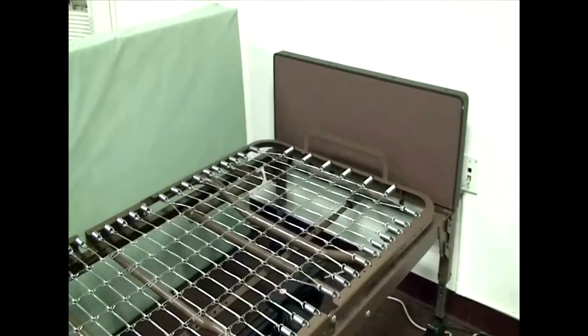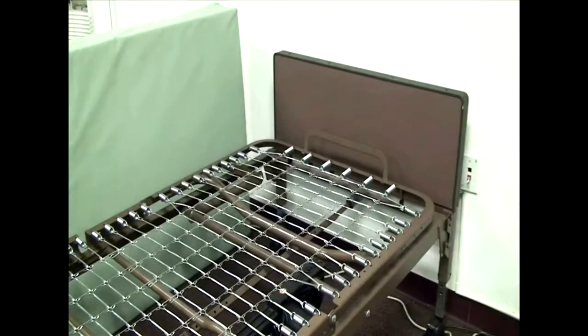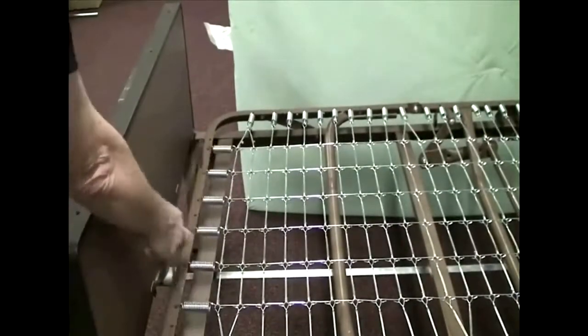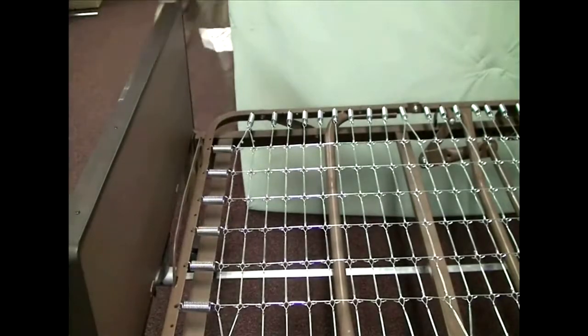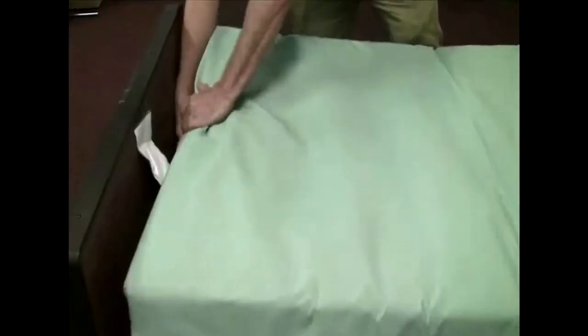We're now ready to install the mattress. On each end of the spring frame you'll find what appears to be a handle — this is actually a guide to keep the mattress in place so it won't move completely from one end to the other, preventing the patient from getting hands or feet stuck between the mattress and the headboard or footboard. Snug one end of the mattress up against one of the guides, then press the other end down and tuck it into the opposing end.